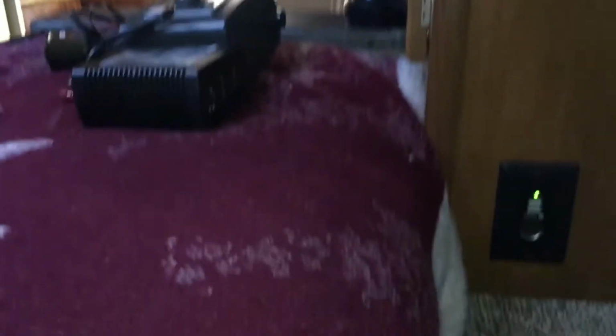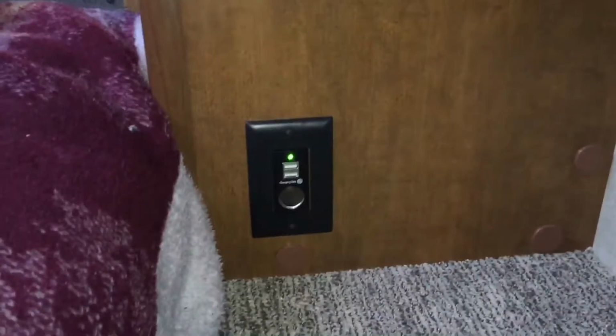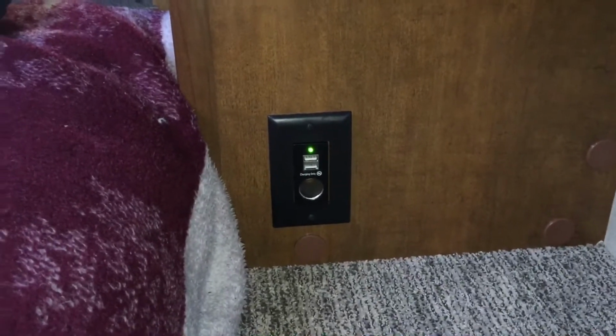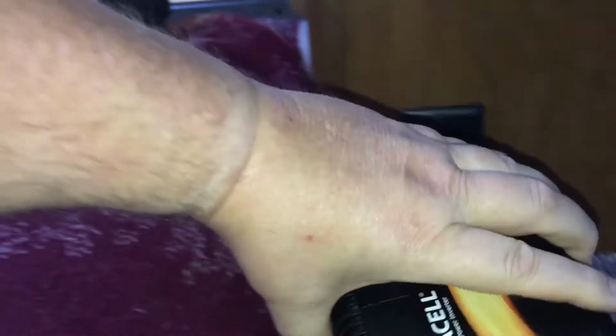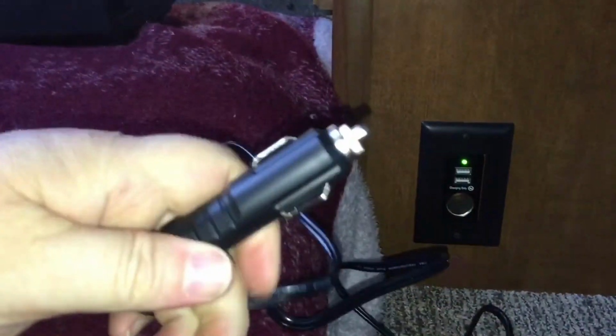And here's your power output. Now, obviously you could plug in up there at the 110, but then you're going to drape your cord everywhere. So that's what I got the inverter for, especially when I turn off the power. So I'll show you how you hook it up. Basically like that.